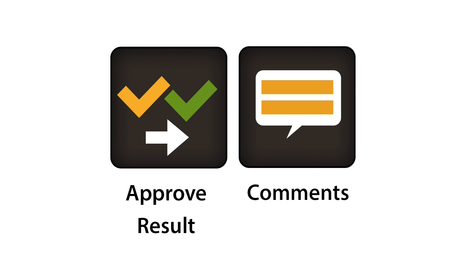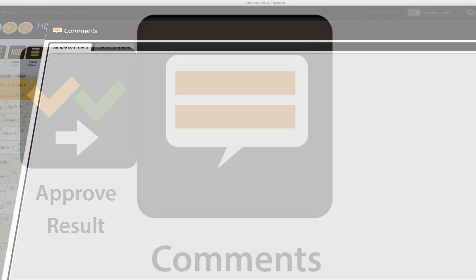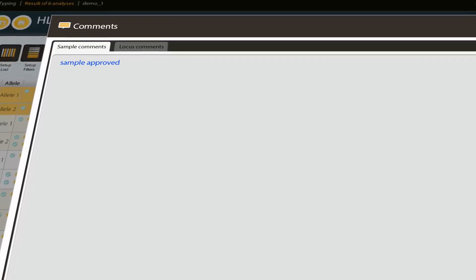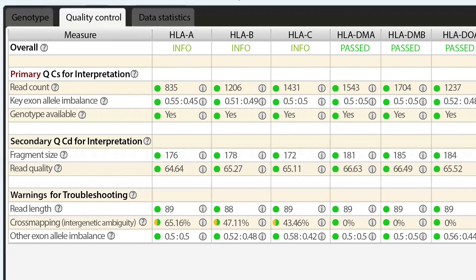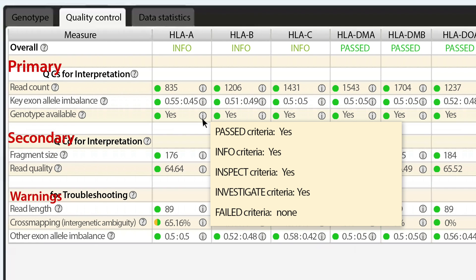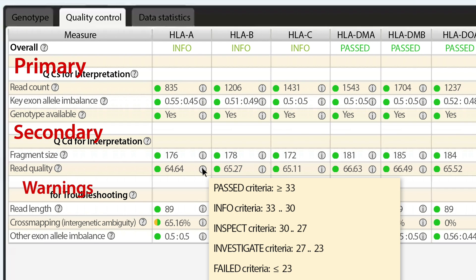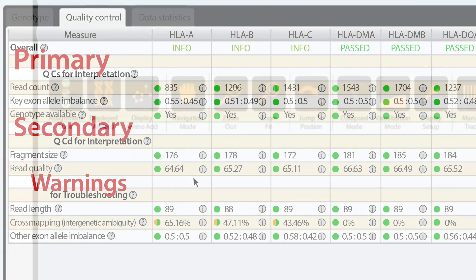Results can be assigned before sample approval and you have the option to add comments to your samples to mark interesting samples or discoveries during research. Each QC metric has an individual threshold and is separated into different groups — primary, secondary and warning groups — based on their importance. By inspecting the QC metrics, you can be confident when approving the genotype of the sample.